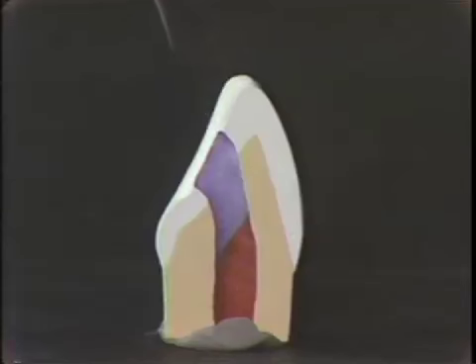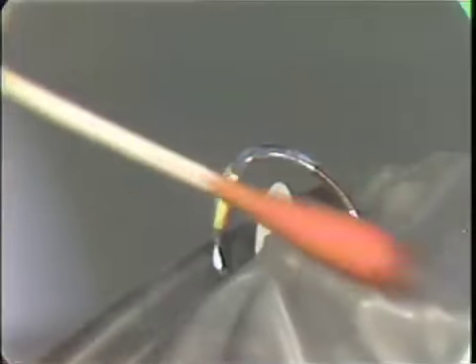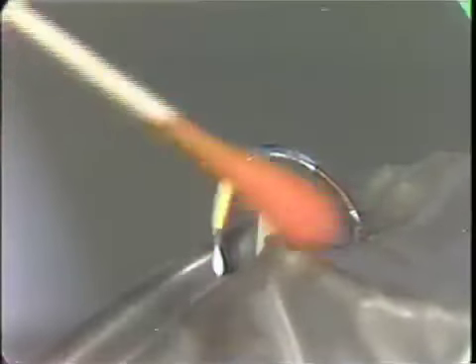Now let me show you the steps of this procedure on an actual tooth. We'll be working on a maxillary central incisor, the same as we demonstrated with the models. As I said before, when working on an actual tooth, the first step is to swab the tooth and the surrounding area with tincture of Merthiolate to disinfect the operating field.